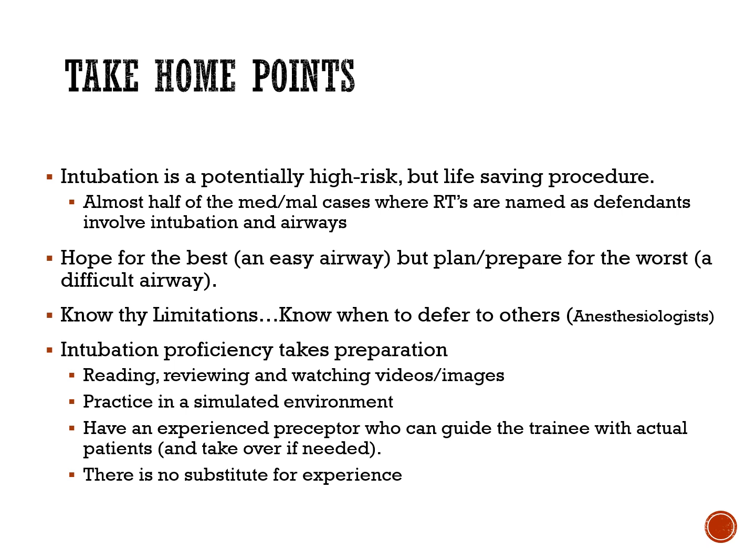Okay, not all of them do. And you may not work in an environment like that. You may work in a small inner city or remote hospital, but in that case, hopefully you have access to, let's say, a mannequin where you can practice. Your institution has a protocol for training and educating you on intubation.